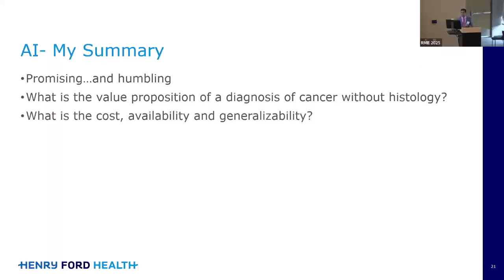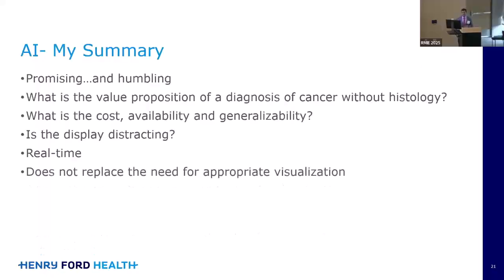Cost, availability, and generalizability are questions that we need to answer as a field. Is the display distracting? When I look at it, if there are things lighting up in my face, it might not be the most appealing way to perform a cholangioscopy examination. It's got to be real time, and any of these programs have to be something that we can look at right then. These tools are adjunctive. They will not replace the need for appropriate cholangioscopy skills, and more to come.